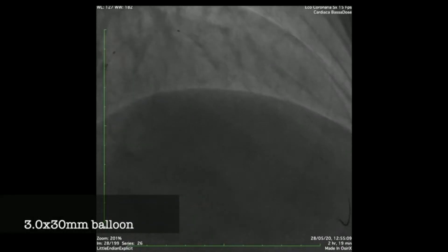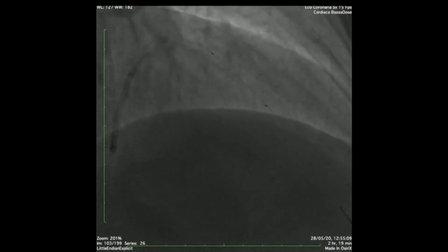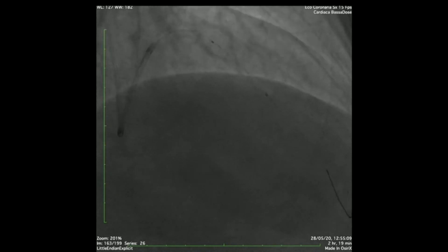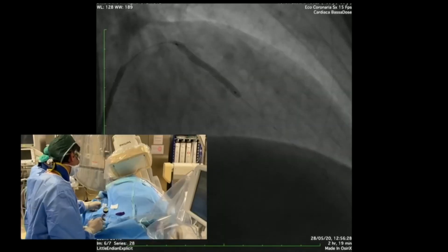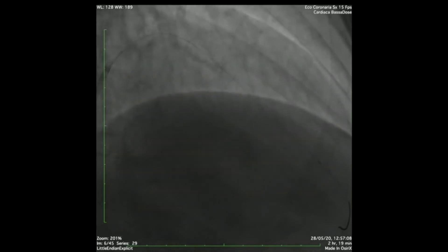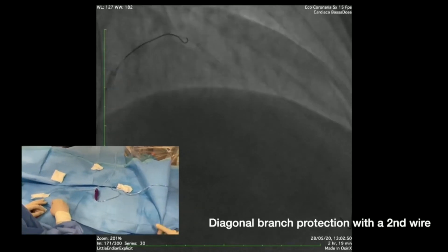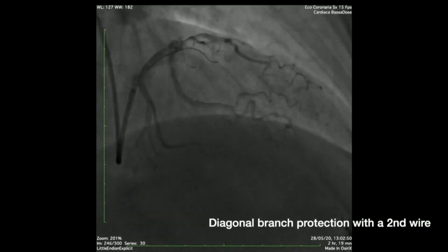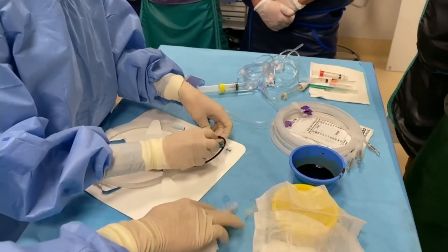Thank you very much, Javier. That was a very nice and useful overview of the available data. Flavio, we learn more and more what to do. In the chat there are initial suggestions on doing intravascular lithotripsy. Please give us a further hint on what happened during the video. Obviously the channel we created with the balloon is not enough to expand the stent well. So we decided to continue with vessel preparation. You see the angiogram — there is a clear asymmetric distribution. We tried with a 30mm long balloon, but we want to know exactly how long this is and whether the distal part of the second diagonal is involved. So we put a second wire to protect the first diagonal, which is involved in the lesion, because we decided to go with the balloon-based approach.